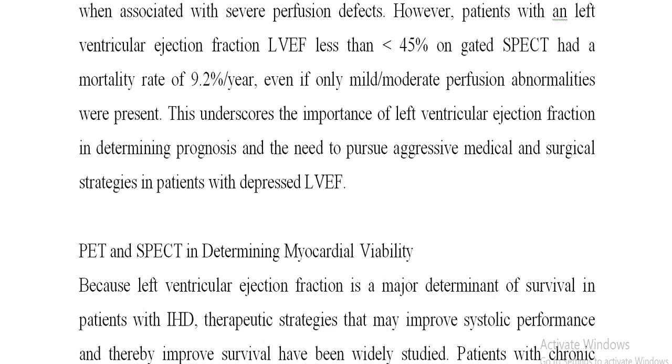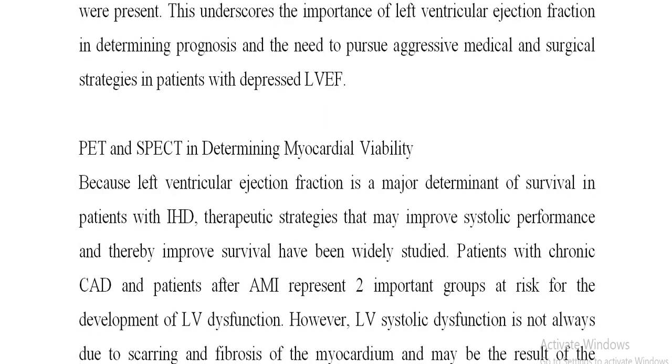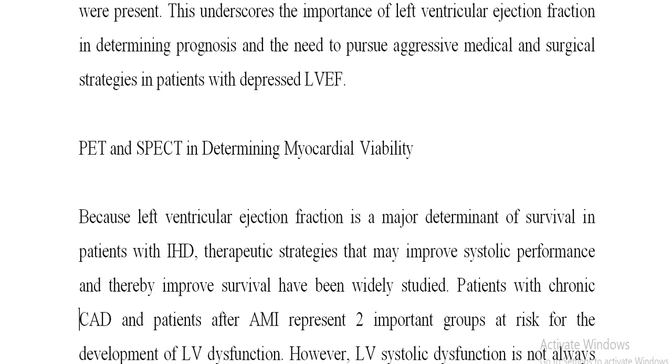PET and SPECT in determining myocardial viability. Because left ventricular ejection fraction is a major determinant of survival in patients with IHD, therapeutic strategies that may improve systolic performance and thereby improve survival have been widely studied.